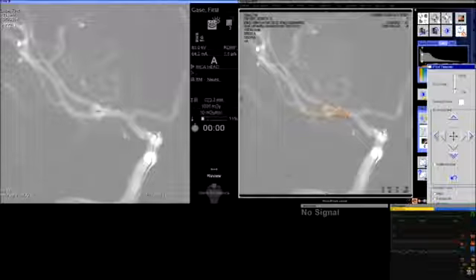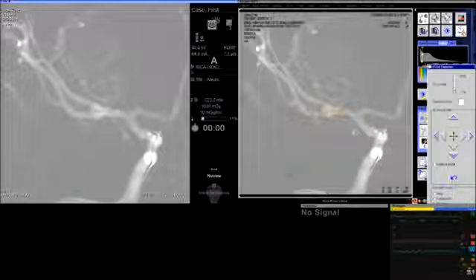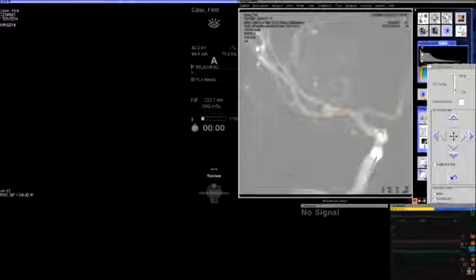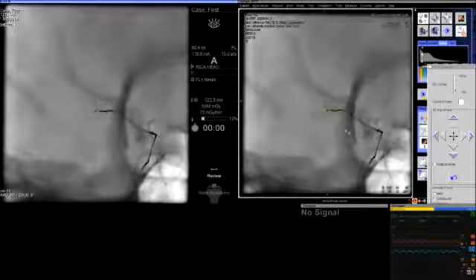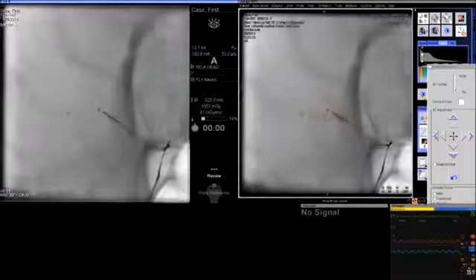And in this case, we have to place very little wire into the aneurysm because this is a multi-lobed aneurysm. The daughter sacs are extremely high risk for possible rupture, so one has to be able to fade in and out the overlay. As you can see on the right side, we're able then to visualize the device as well as the boundaries of this anatomy that is quite complex. But the moment that we're comfortable that the microcatheter is in position, we're able then to confirm that in multiple views and position our tube into the best angle possible to start the coiling procedure.